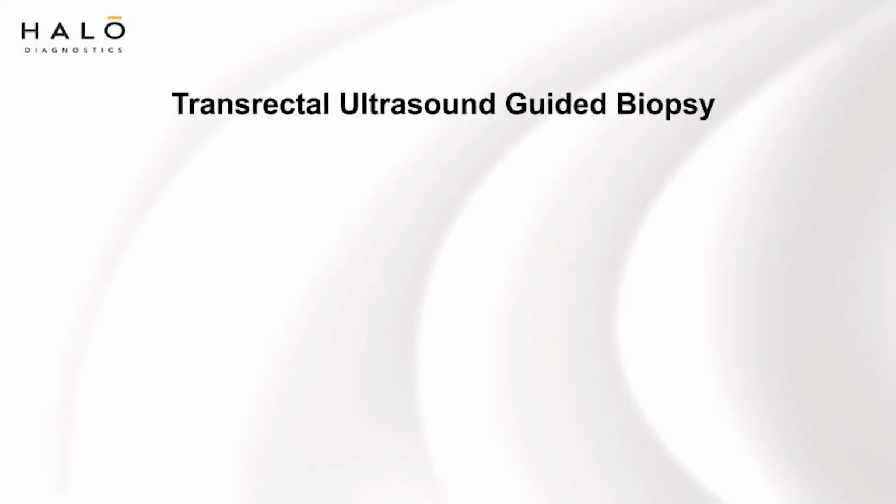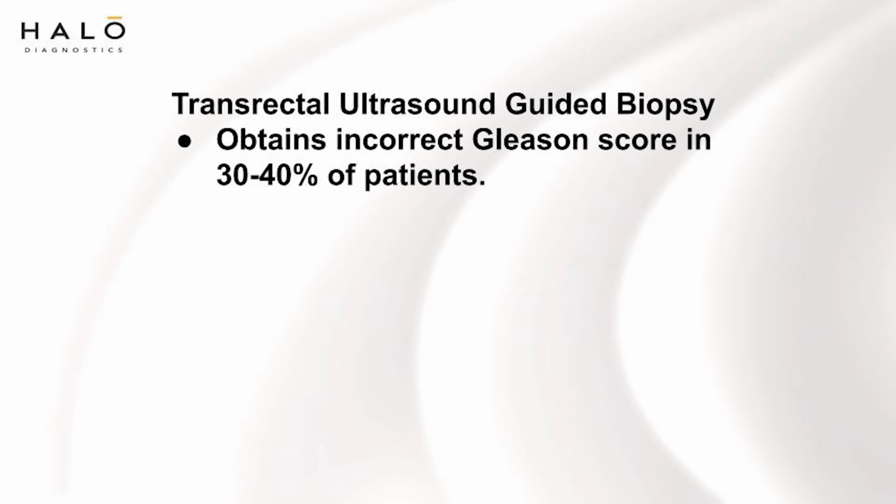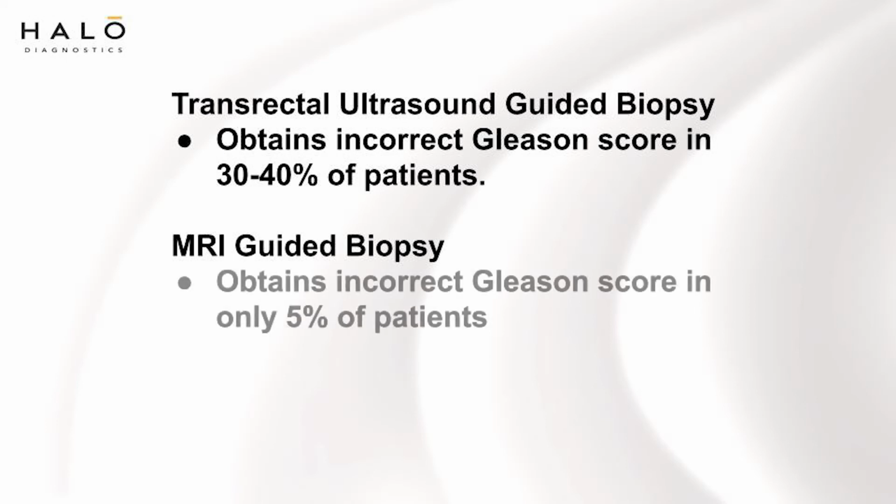The other advantage is that the Gleason Score, which is a measure of how aggressive a prostate cancer is, is the most important marker for determining the prognosis and therapy of a prostate cancer patient. The old transrectal ultrasound-guided biopsy gets the Gleason score incorrect in 30 to 40% of patients. Using MRI to target the biopsy, the Gleason score is obtained incorrectly in only 5% of the cases.